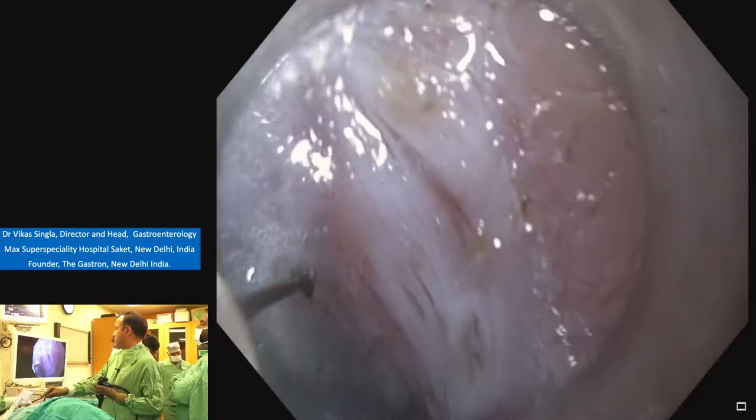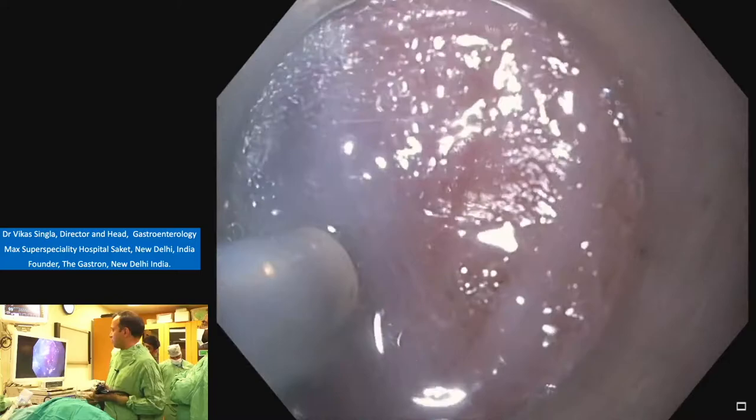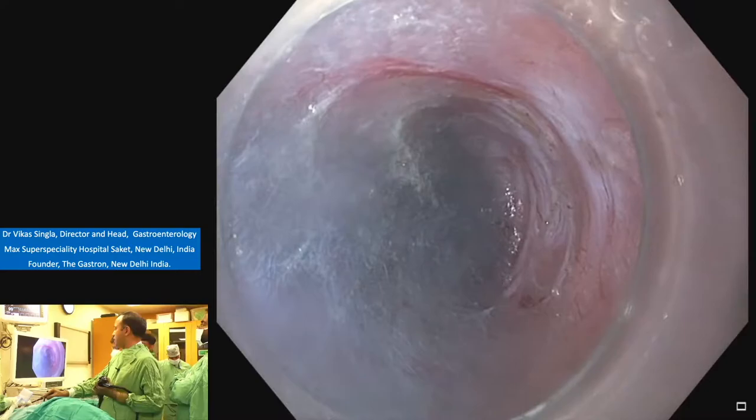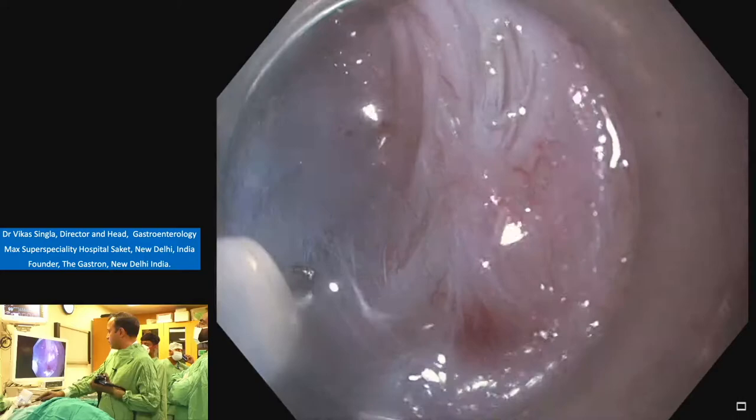And POEM should be done with the CO2 only. POEM cannot be done with the air. Inject. And we can see on the right side is the muscle layer and on the left side is the submucosa and the mucosal side. Again we are injecting fluid. You can use either the indigo carmine or the methylene blue. We are using here indigo carmine.